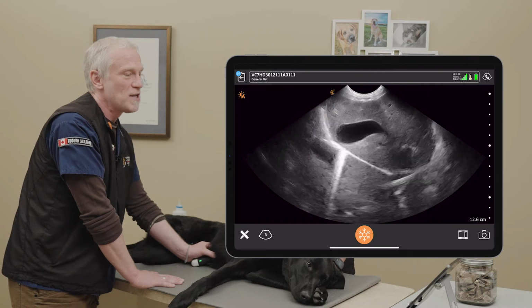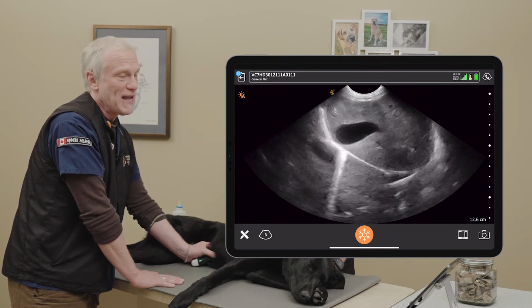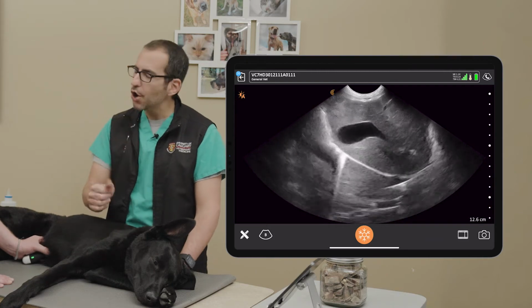In this case, seeing 1 to 3 B-lines at this location coming off the diaphragm would be normal. But if we have increased numbers, then that is a concern as well. 100% epic Jedi fight right there, Dr. Boysen.